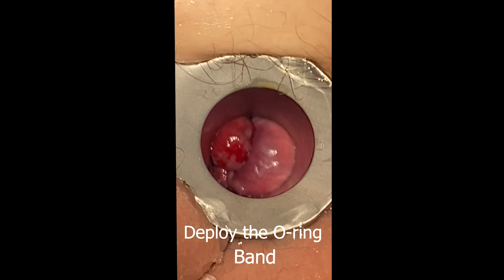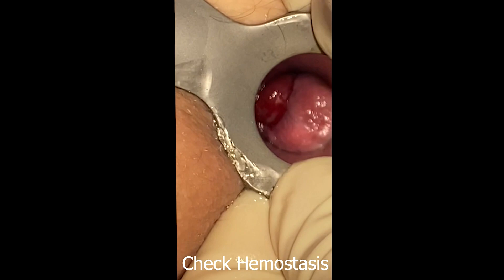Deploy the O-ring bands. The patient should not feel pain as we are above the dentate line; however, if they report immediate severe pain, the band has most likely incorporated the anaderm. The band should be removed with a band cutter, but some patients may need to be taken to the OR for removal. Check for hemostasis prior to removal of the anoscope.